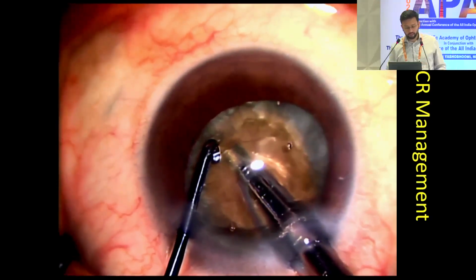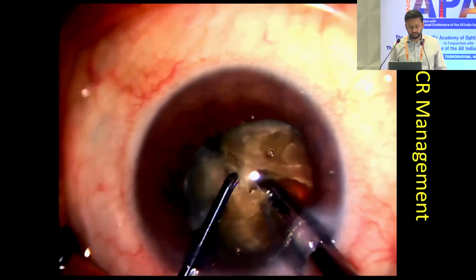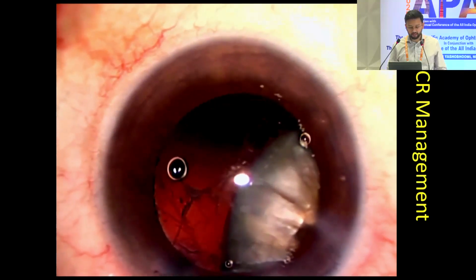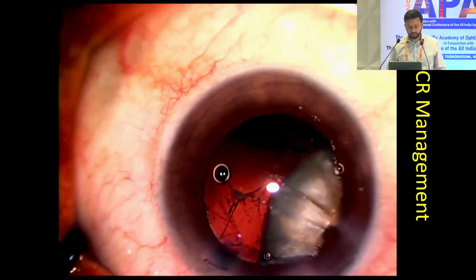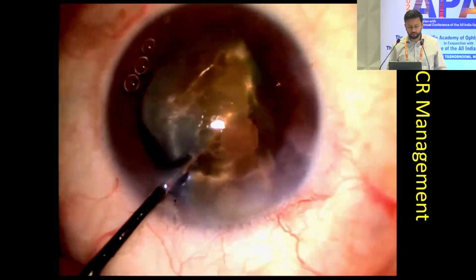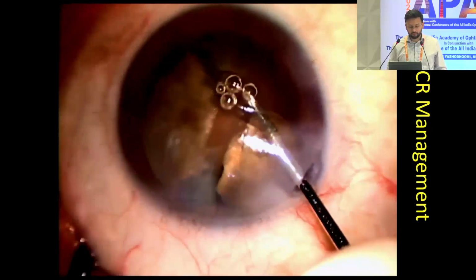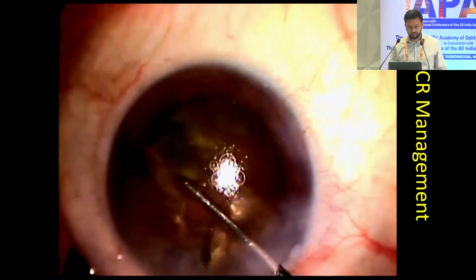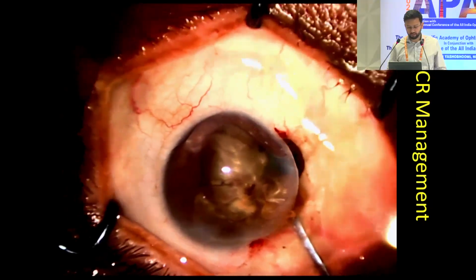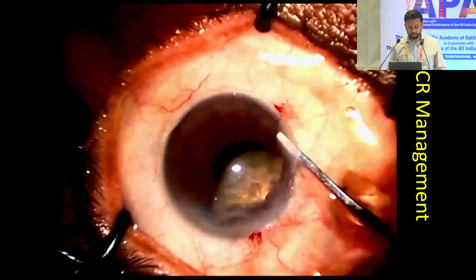So all the time we cannot have such positive results. This was a very hard cataract, and while attempting chopping of the nucleus, we realized that there was a pre-existing PCR, or this PCR was created during hydrodissection, and the nucleus was almost slipping down into the vitreous. We levitated it with an MVR, brought it above the iris, attempted to fragment it, and converted into an ECCE. We expressed the nuclear fragments one by one.